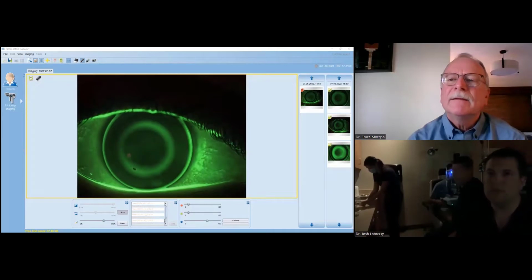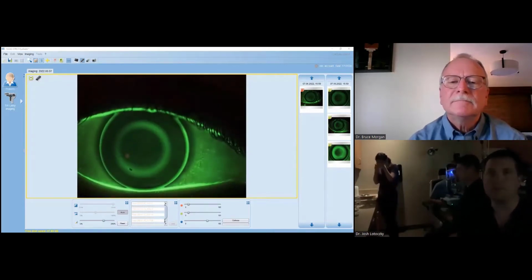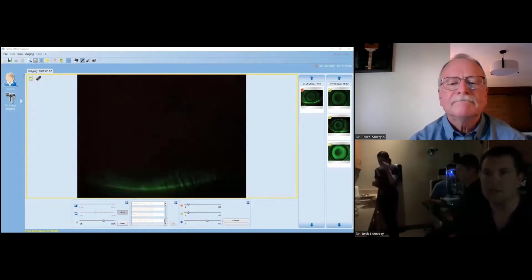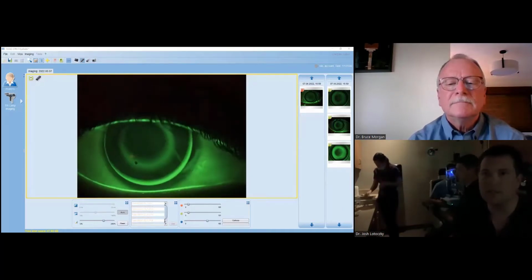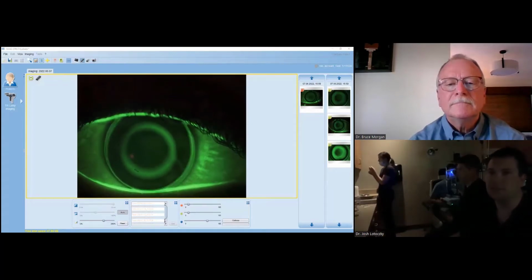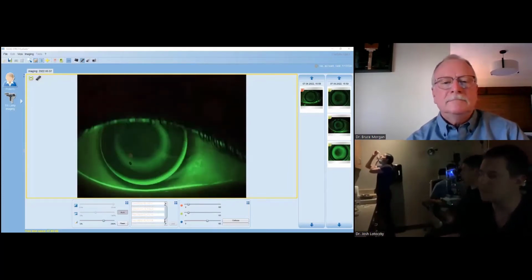Yeah, and when you look at that, one of the things that I usually will say too is just start from the center and work your way out. We know the different curves to the lens. If the lens is not completely decentered off the eye, I look in the center of the lens and ask what is not only the shape of that treatment zone, but also the size of that treatment area, which is going to be that darkened central area that we see.